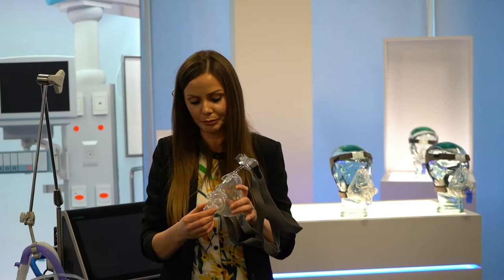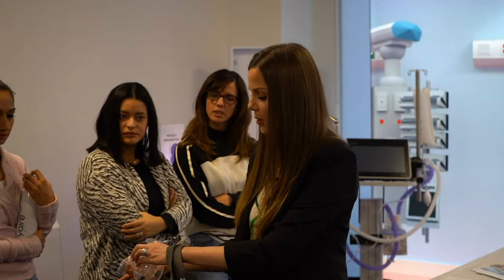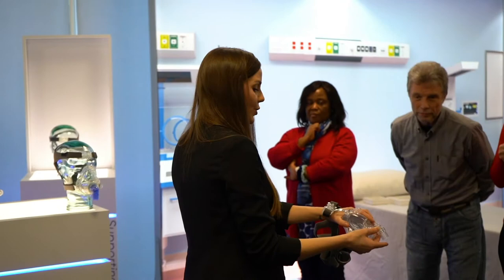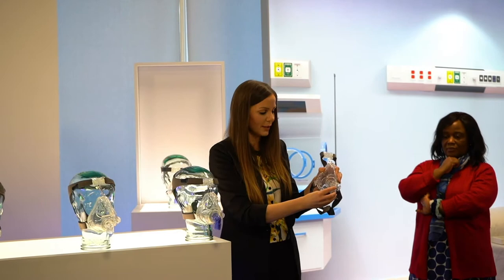Okay. Another feature here is, again, I'm going to have to show you because you're not going to be able to see it. Do you see these holes here? These little holes here, we call them different things. We call them vented. So this is a vented mask. And we do masks that are non-vented that wouldn't have these holes. These little holes here allow for CO2 gases to come out of the mask. So like I said, the patient's not rebreathing their own CO2. So this is a vented mask with an AAV, the anti-asphyxiation valve, okay? So these holes here would be used on a circuit, a single limb circuit with no valve, okay?